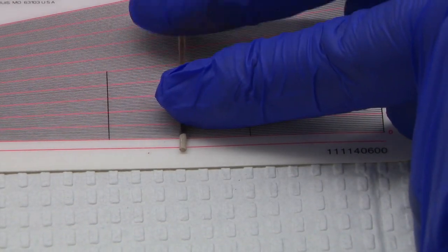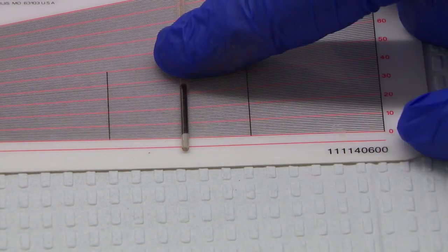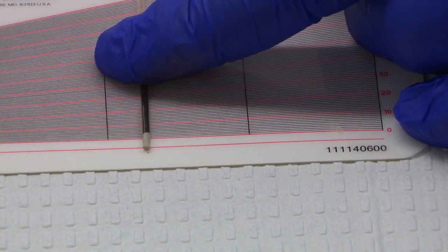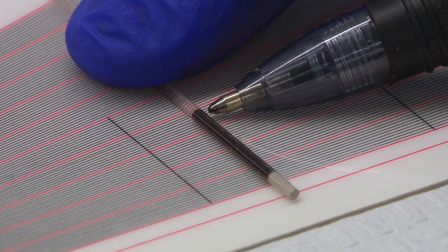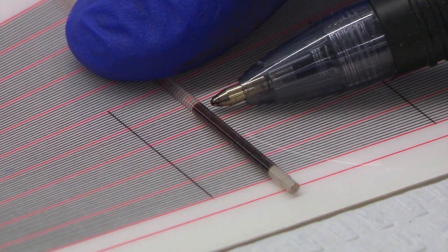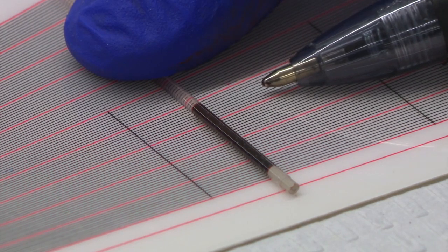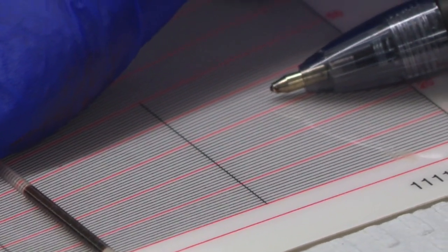Move or roll the tube along the card until the meniscus of the plasma aligns with the 100 mark, which is the top line. Once you find this point, look at the line at the top of the packed red cells, excluding the buffy coat.